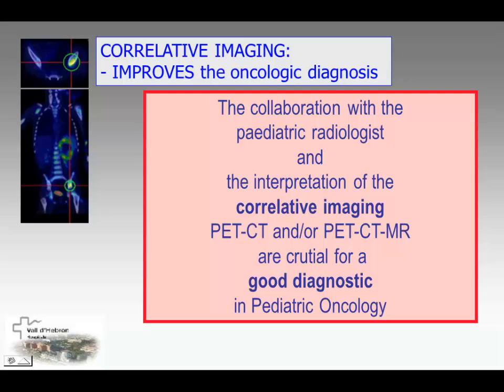Or if during the treatment, instead of differentiation, the tumor becomes undifferentiated, and you have any discordance between the clinical symptoms and the MRI or the MIBG images, or discordances between the MRI images and the MIBG images, then it is advisable to perform a PET with FDG.